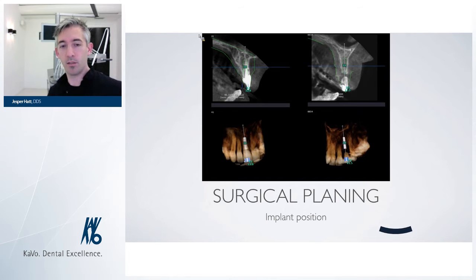So here we have the option to plan the implant position really exactly in regards to the final prosthetic work that we're going to do. The lower pictures are some pictures where we have either planned something immediately or where we have some kind of outline in place in the mouth at the time the X-ray picture was taken, to guide us. Today we do a digital plan, a digital wax-up, and plan from that.